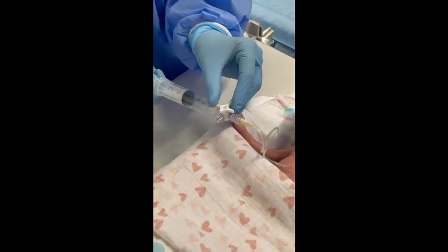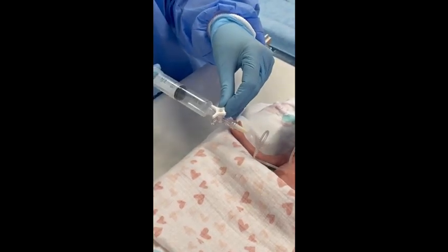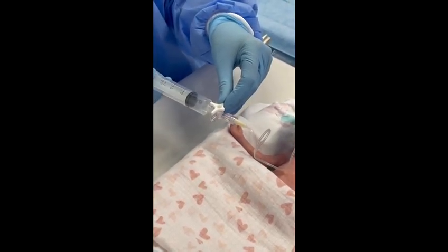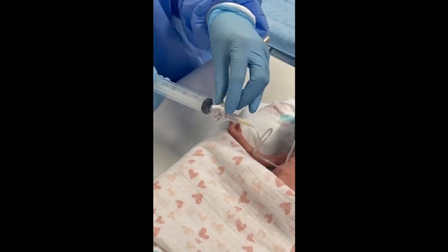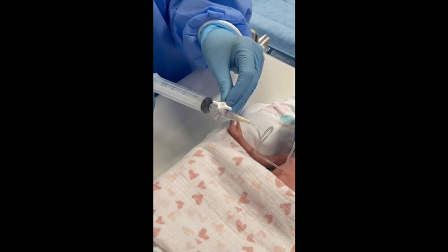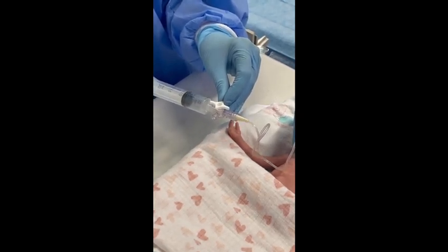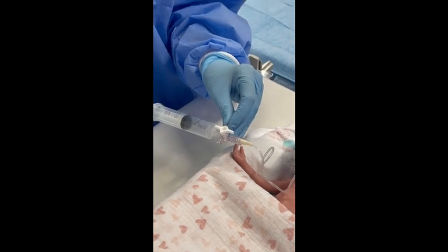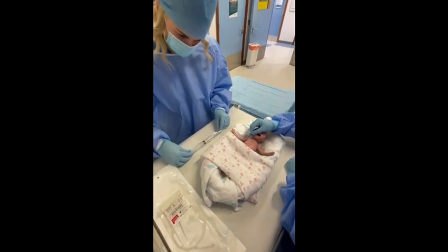Aspirate the air into the syringe, and when the syringe is full, expel the air into the atmosphere via the tap. Ensure the 3-way tap is in the correct configuration to avoid injecting air back into the pleural space. Repeat aspirations if air reaccumulates or until an intercostal catheter has been inserted.